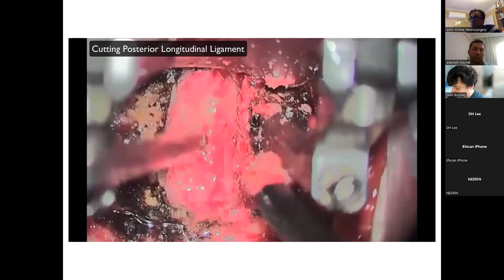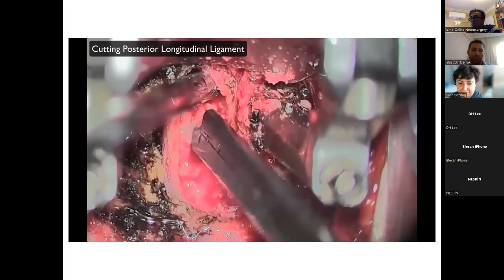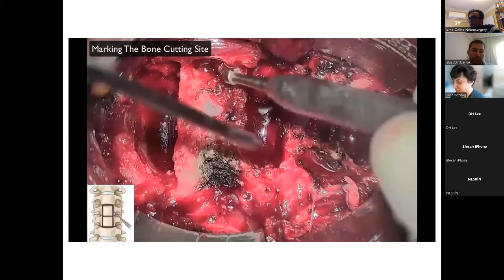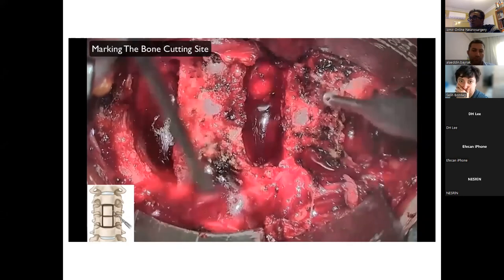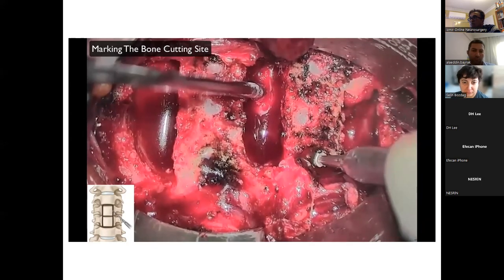After removing the discs at the targeted levels in a routine manner, the posterior longitudinal ligament is excised at the uppermost and lowermost levels to mobilize the vertebral bodies in between. Next, the targeted site of bone resection is marked.